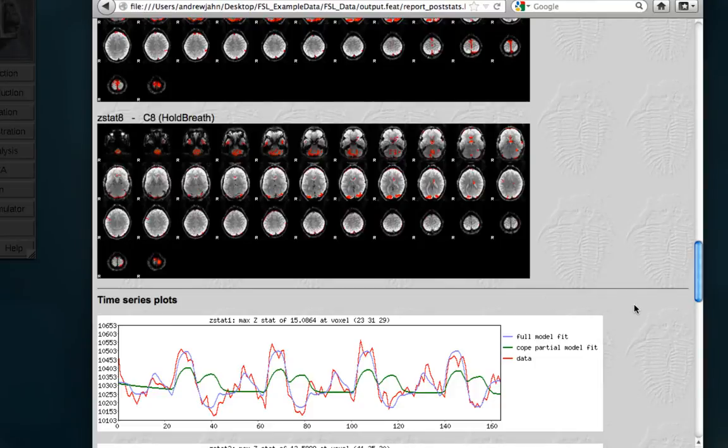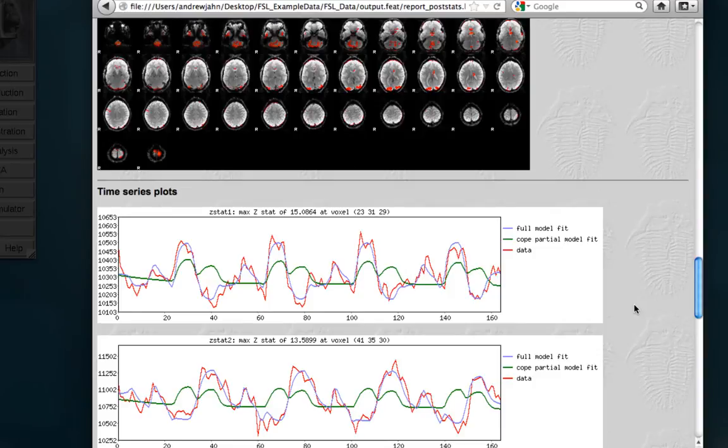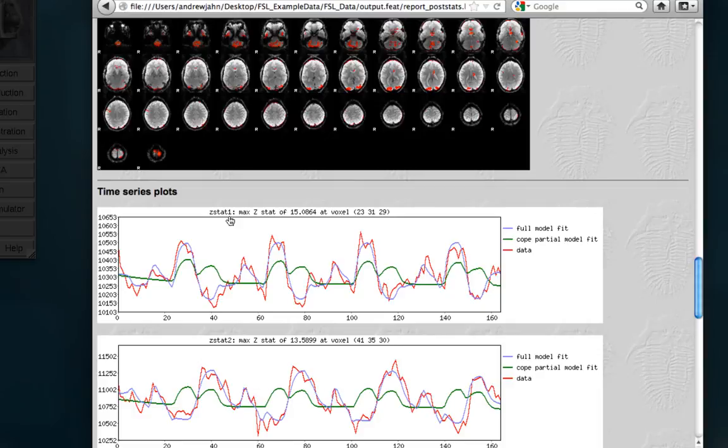At the very bottom, we see a series of time series plots, which show you both the full model fit, which is the entire linear model with all the regressors thrown in there, at each peak voxel for each contrast. So, for example, Z-stat 1 refers to the first contrast we specified, which was left minus right. And it's a peak Z-score of 15, roughly, at this voxel coordinate.